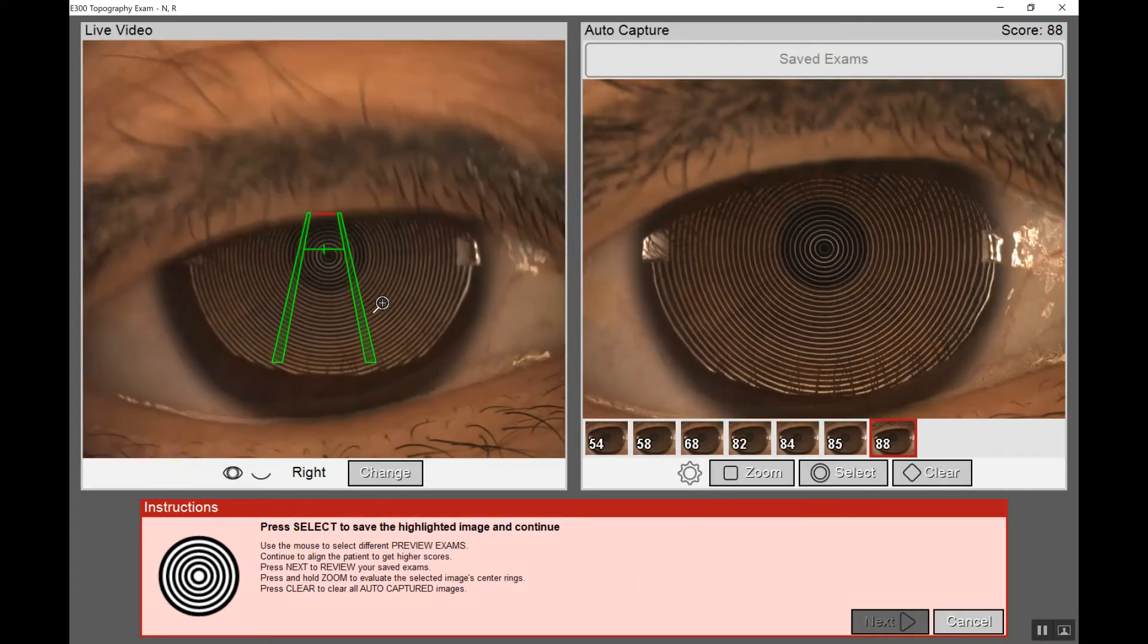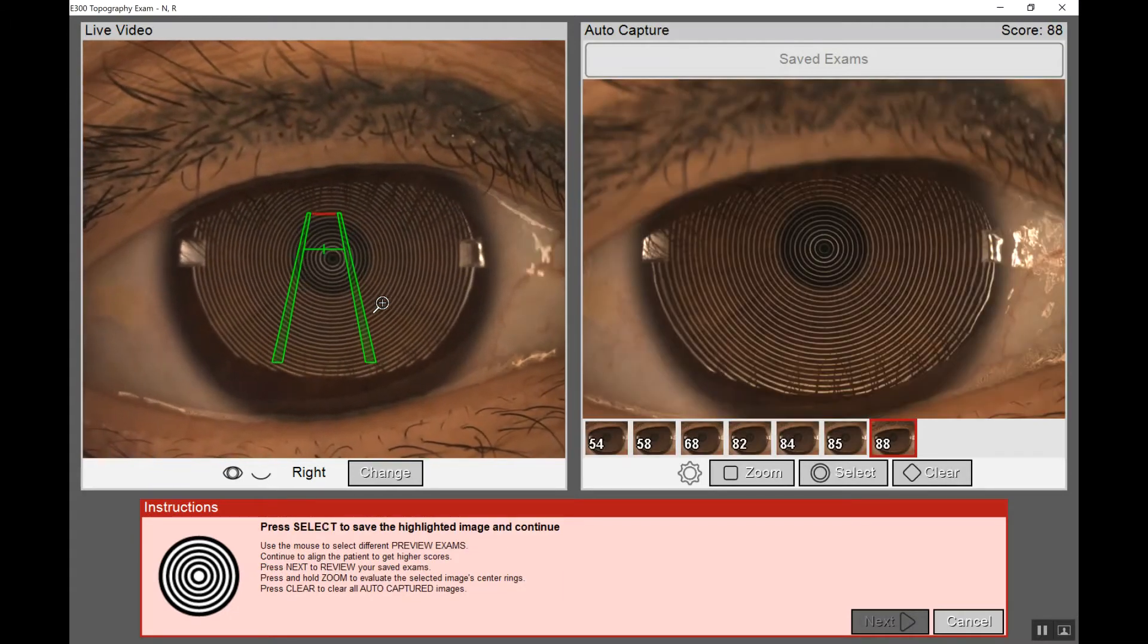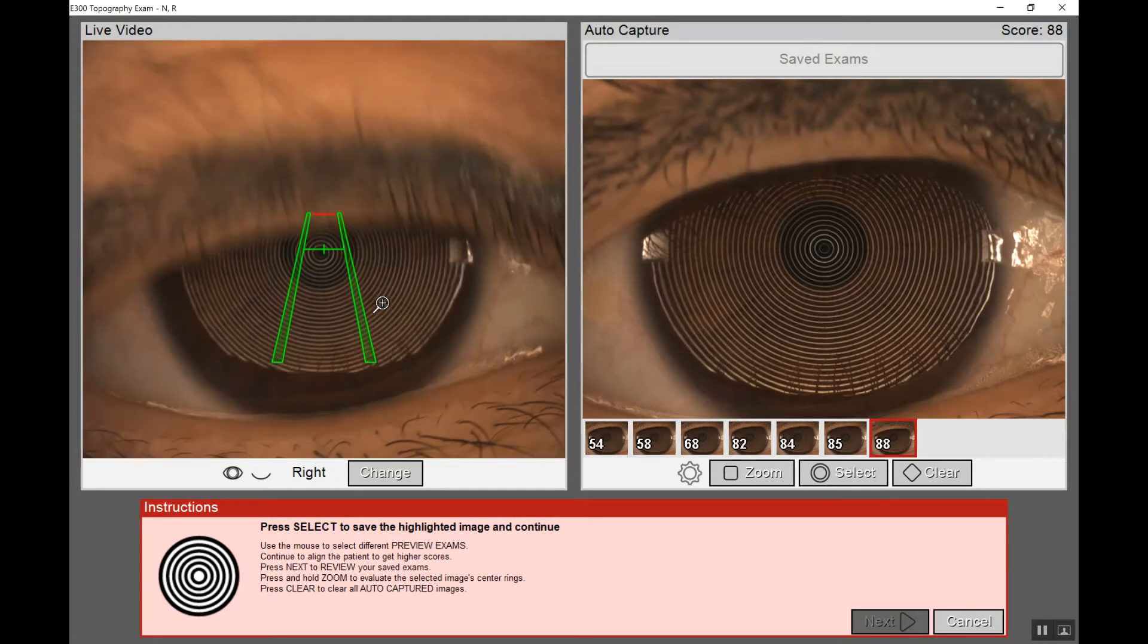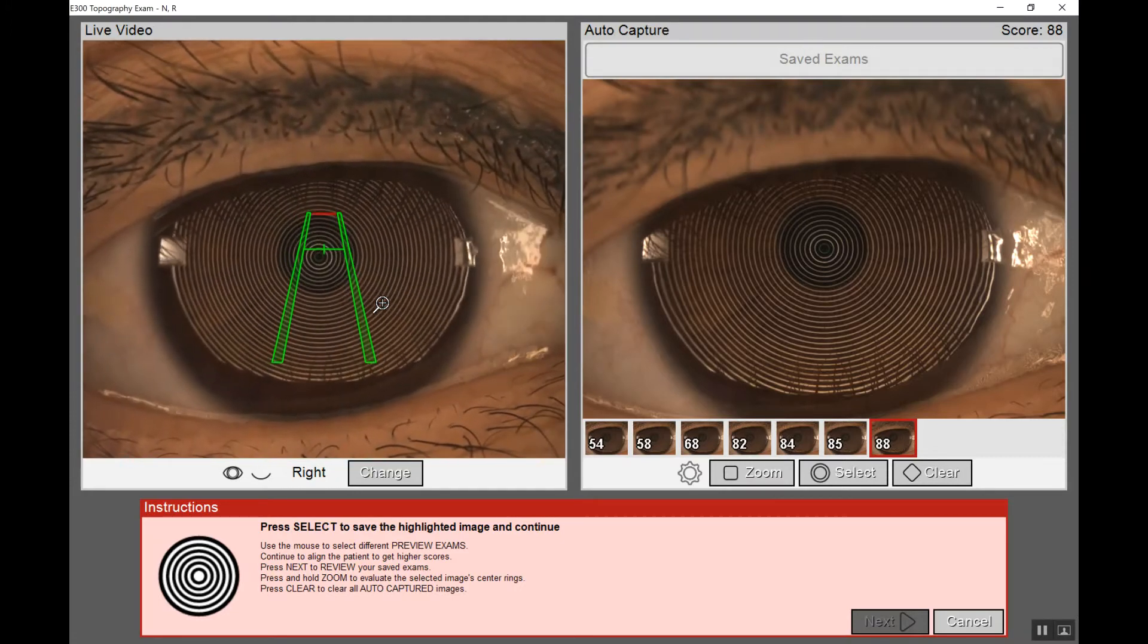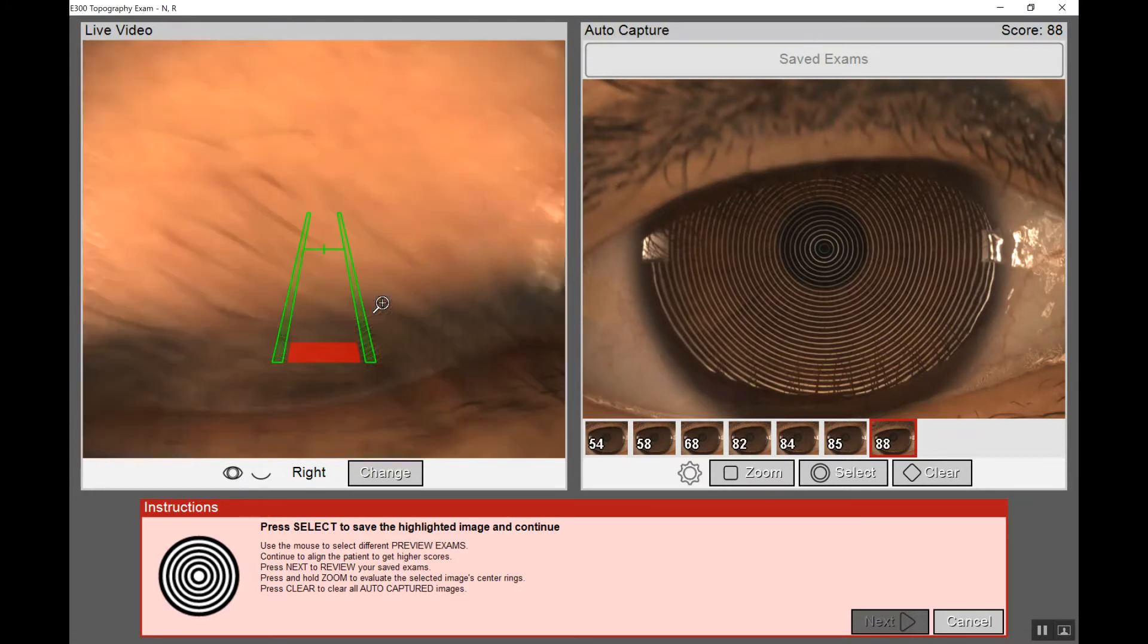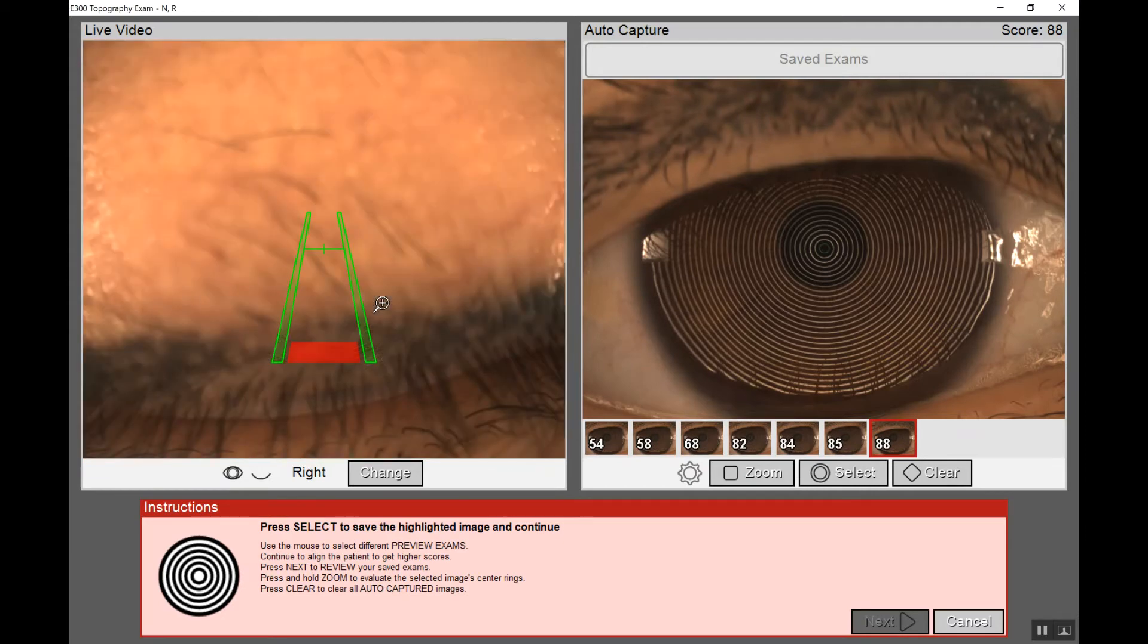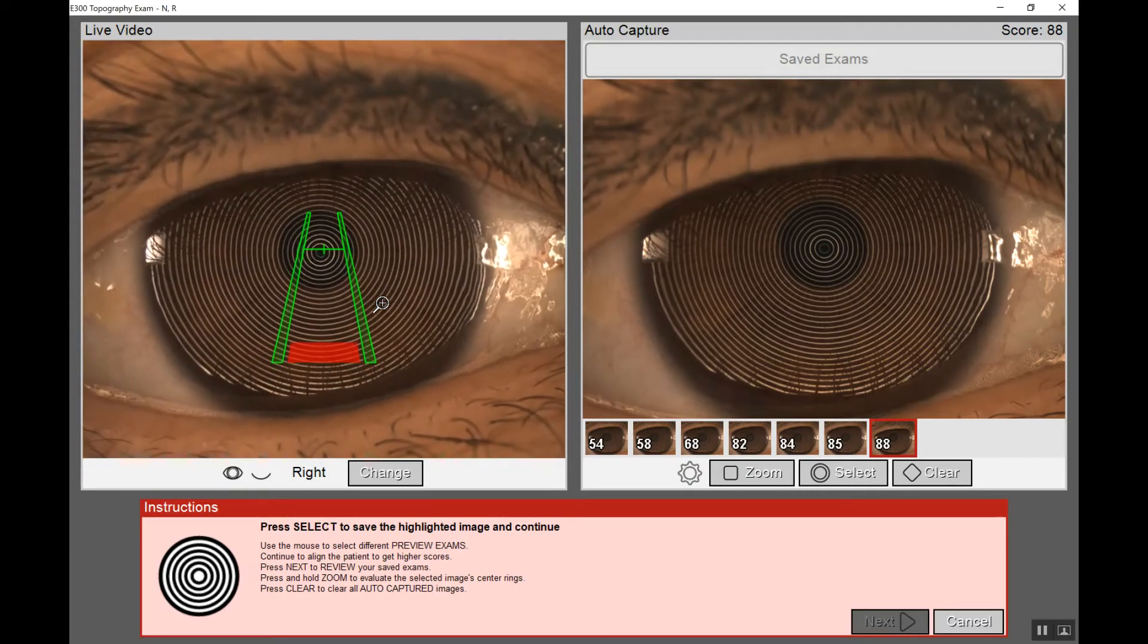Next, while the red lines at the top of the runway were too far away from the patient, we need to move the instrument forward, while the red lines at the bottom of the runway were too close to the patient and need to move it back.